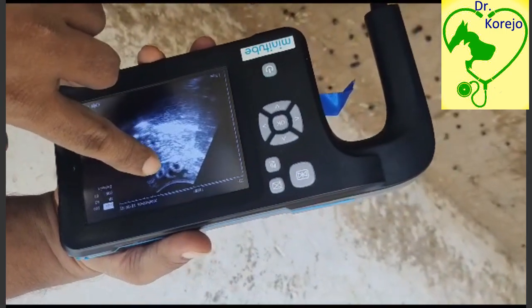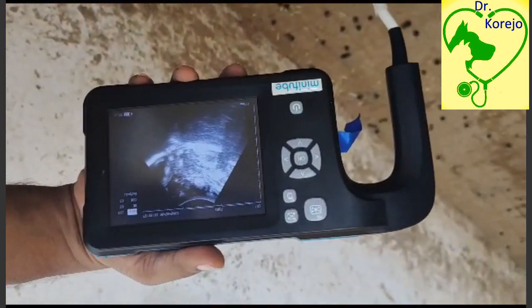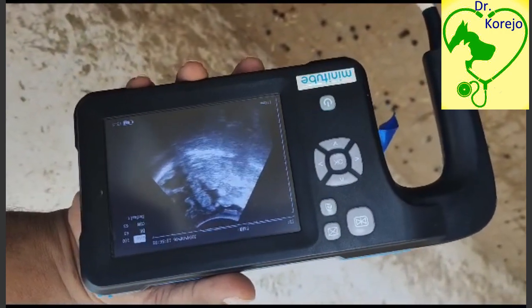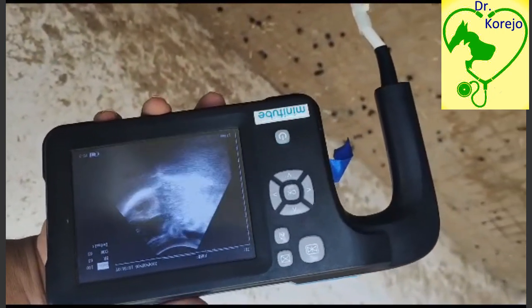Yes, yes, it is good. Take a look and take a look. It is gone. Is that what it is? Right.